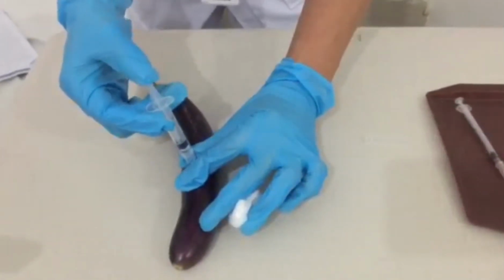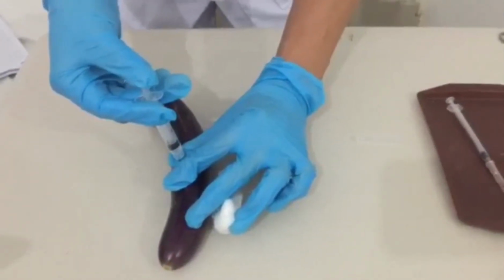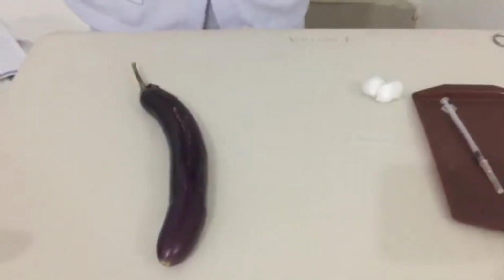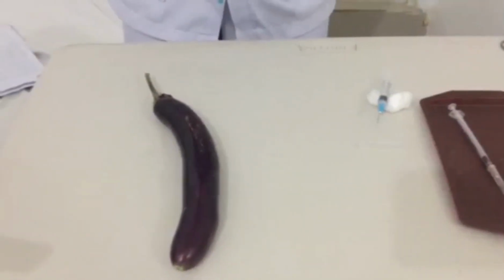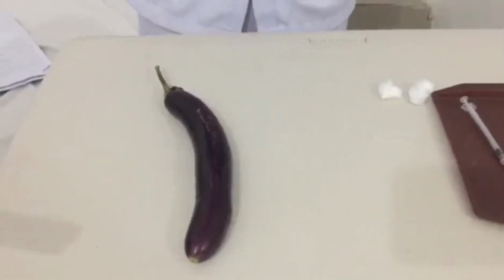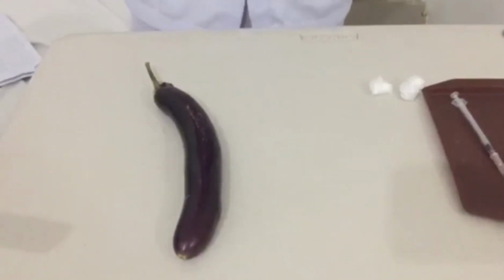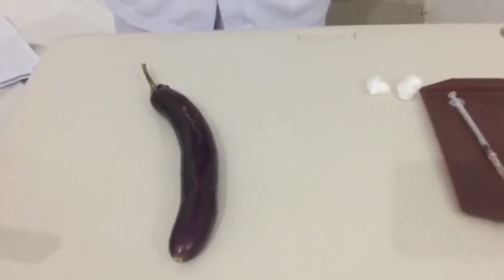If blood appears in the syringe, withdraw the needle, discard the syringe, and prepare a new injection. If blood does not appear, inject the medication steadily and slowly, approximately 10 seconds, and withdraw the needle. So after I withdraw the needle smoothly at the same angle of insertion, as you can see, I then apply gentle pressure at the site with a dry sponge.